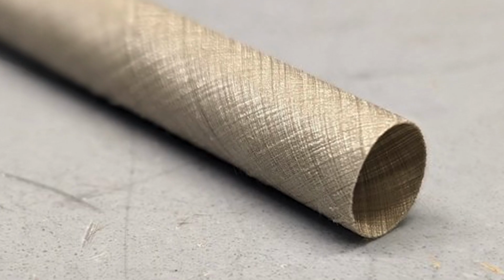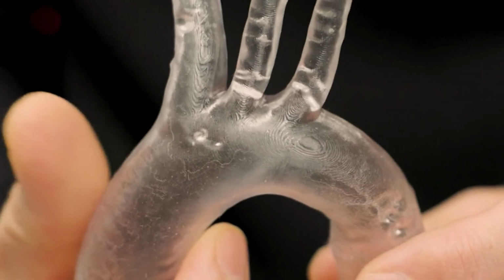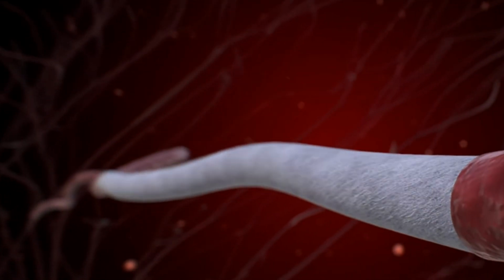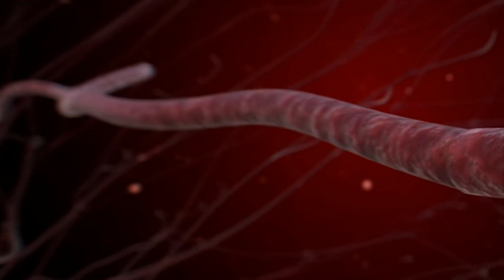This biodegradable graft is a tough, stretchy straw. It not only expands and contracts like the veins or arteries as the blood pumps through it, it also absorbs into the body as new cells grow in and around it and take their own place. So even though this artificial graft will be placed, eventually the body will grow new vascular cells and the artificial graft will degrade and go away by itself.